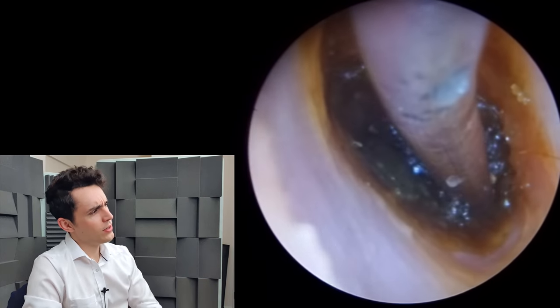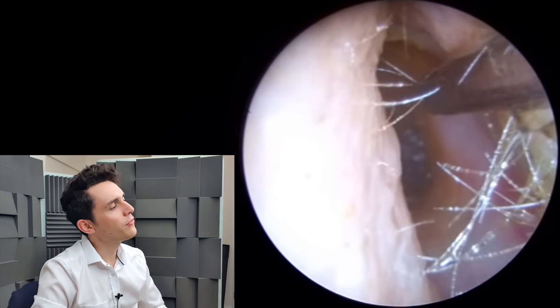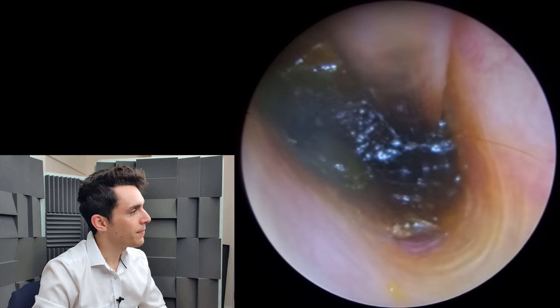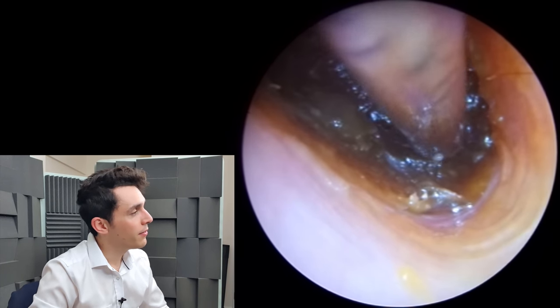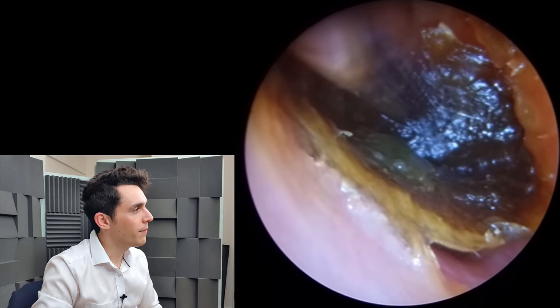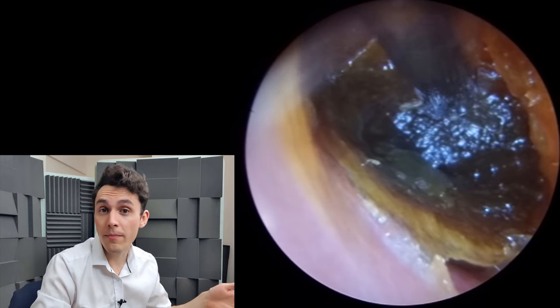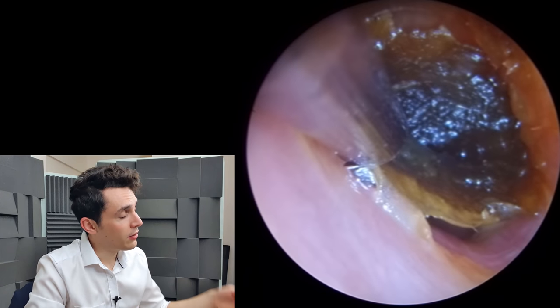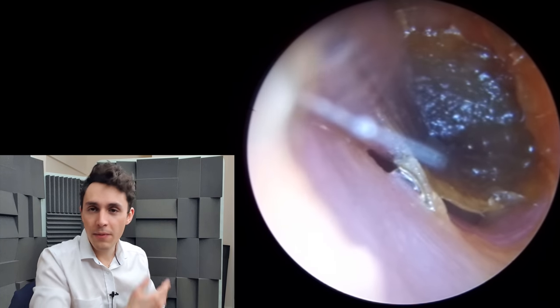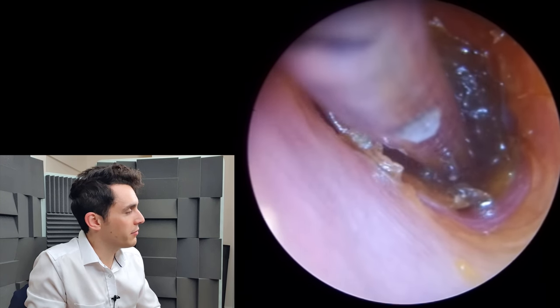You may be thinking, can't you just go in on the side or do something different with it? The reason I'm being a little bit careful is because we're so close to the eardrum. The skin in this part of the ear canal is extremely sensitive. When you're working this deep in the ear, this close to the eardrum, the last thing you want to do is apply a little bit too much pressure or nick the side of the canal, make the patient jump, cause some bleeding — and then you're in some trouble.